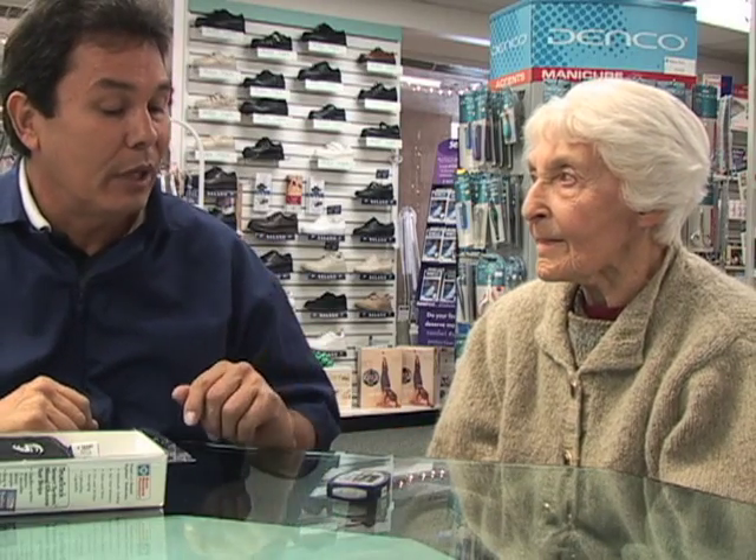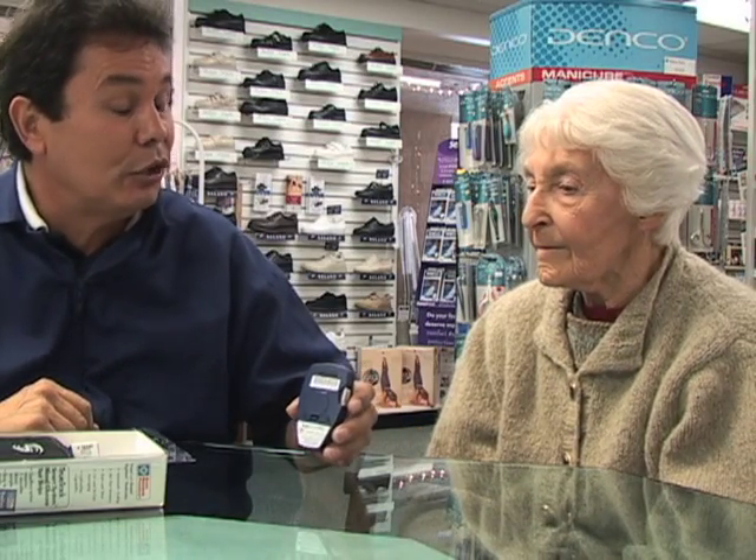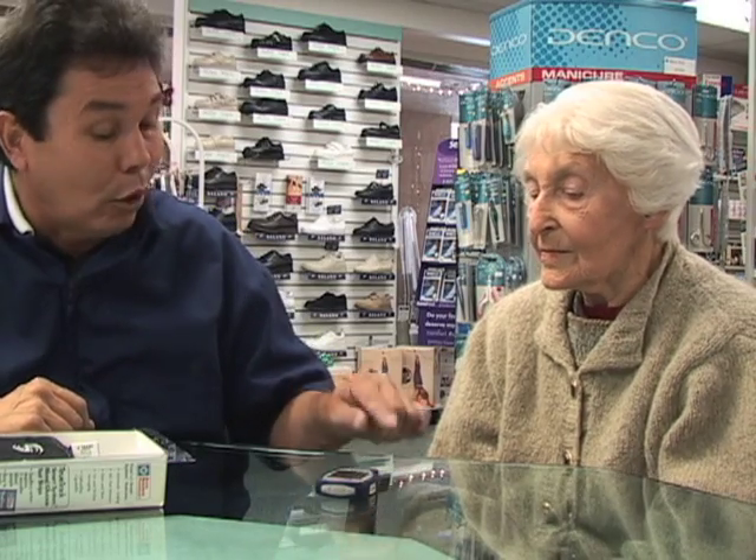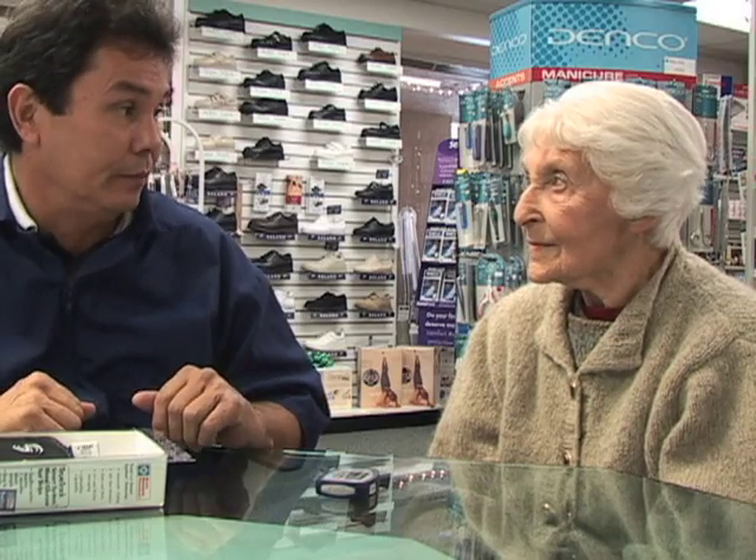First, Joe shows Mrs. Nelson how to use the control strips that come with the monitor. He informs her that this is the way to ensure that her machine and her strips are testing properly and providing an accurate result.